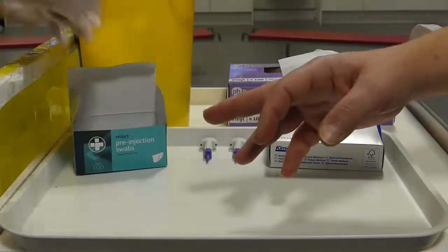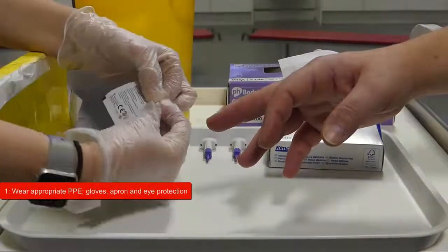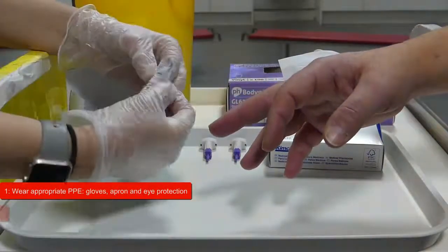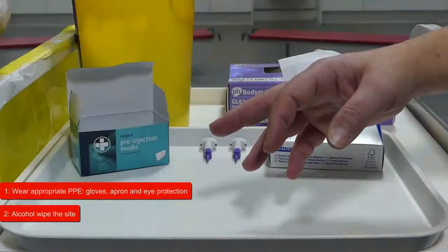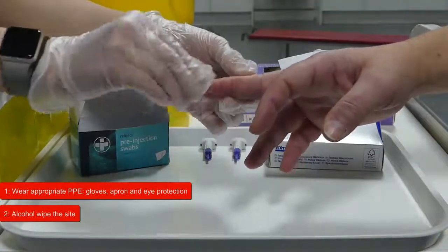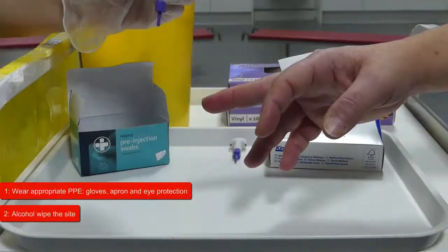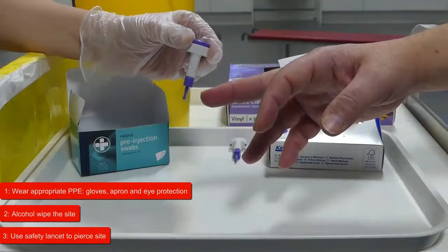We'll watch this again as a quick recap. First ensure you're wearing appropriate PPE. Then alcohol wipe the site. Next using the safety lancet pierce the site.